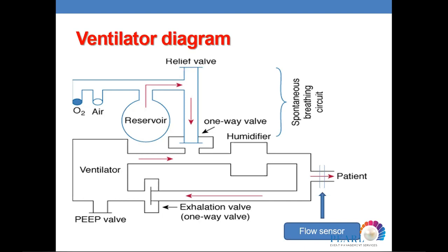When the inspiratory cycle finishes, the valve will open, so the pressure is lost. The pressure will go down, so the air will go from the higher pressure to the low pressure, and expiration will happen. So this is just a basic understanding.